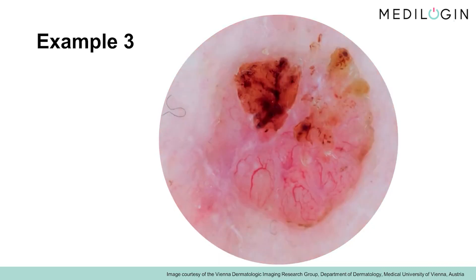Let us now switch to another example. In this example, the characteristic criteria for a basal cell carcinoma are particularly interesting. The only pattern present is one made up of lines. Here, you can also recognize the spoke wheel, that is, the common base and radial lines extending from it. Since the lesion is predominantly skin-colored, the vessels can be assessed easily.